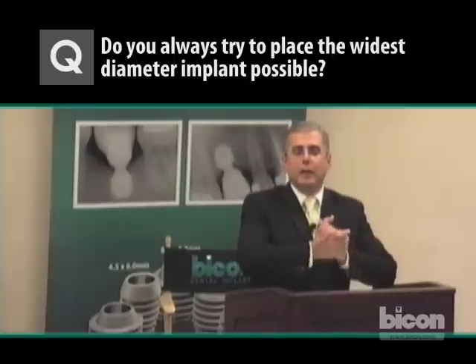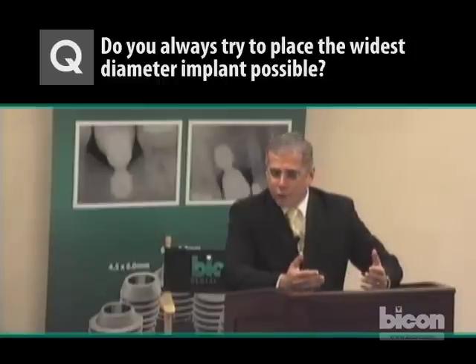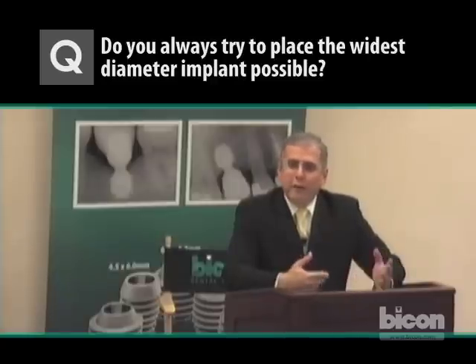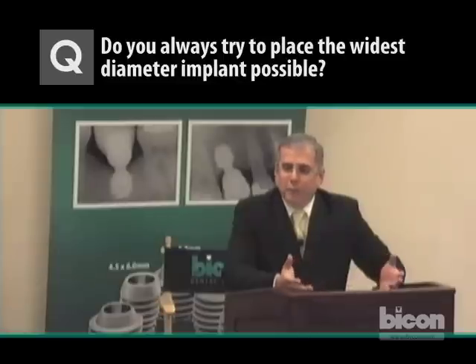With the BICON implant, you have the latitude to get pretty close to adjacent teeth — within one millimeter — and you will have integration. The idea is to increase surface area without having to use a much longer implant, so we try to get to a wider implant. If the widest available is 4 millimeters, so be it; if it's 6 millimeters, we go after that diameter. A 4.5 by 6 is adequate for any molar or bicuspid. Five by six, five by five, six by five, and six by 5.7 — all of them work. Thank you again and have a great rest of the day.